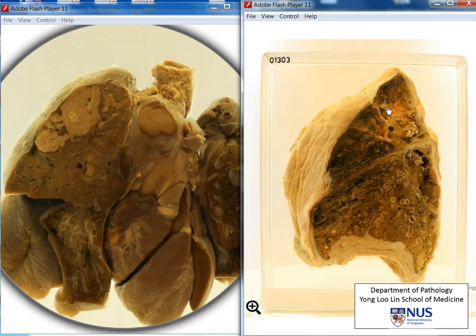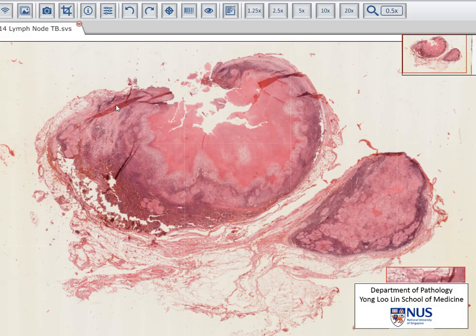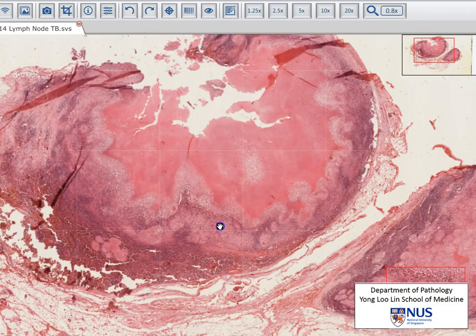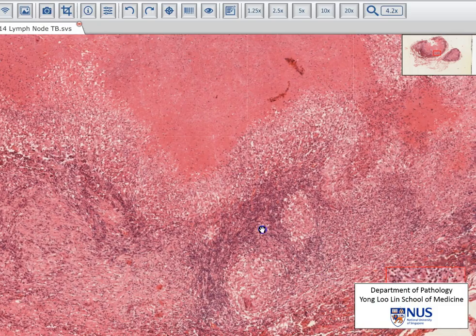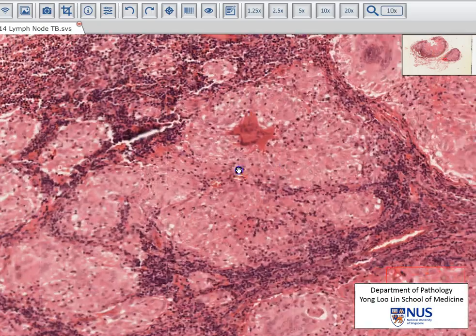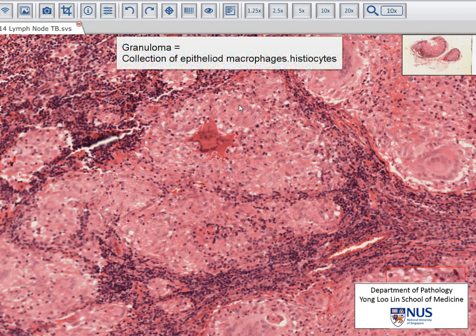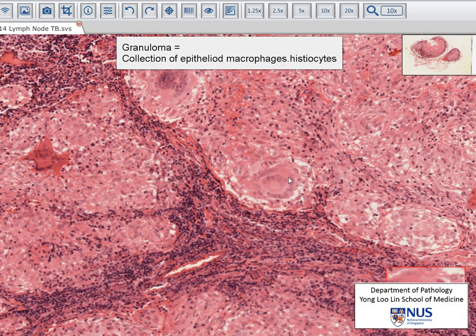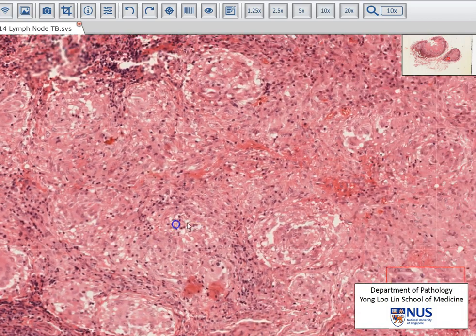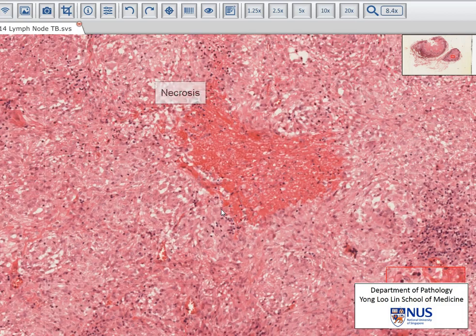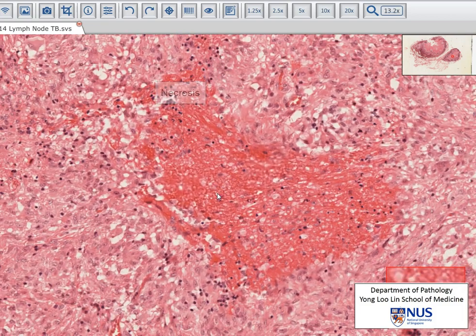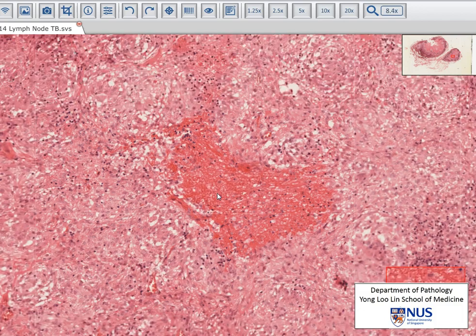Microscopically, here are two lymph nodes that are involved by TB. The process is the same as what you would see in the lung, and this would be necrotizing granulomatous inflammation. I'll just show you a smaller granuloma here. A granuloma, if you remember in your chapter on chronic inflammation, is a collection of activated or epithelioid macrophages. We can sometimes see these Langhans giant cells. And in the center of some of these larger granulomas, we can also see these dark, redder areas, which represent caseous necrosis. So on microscopy, what we are seeing is necrotizing granulomatous inflammation.